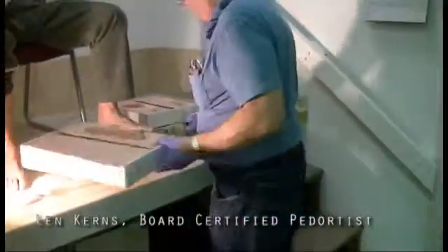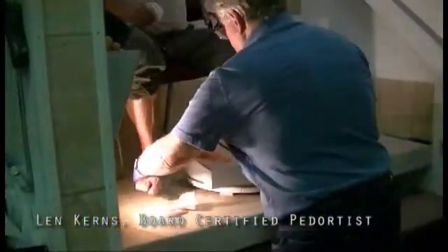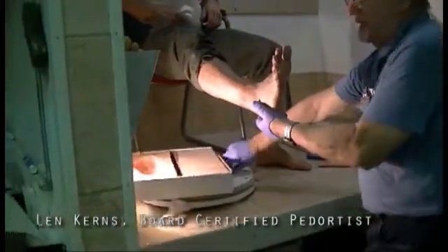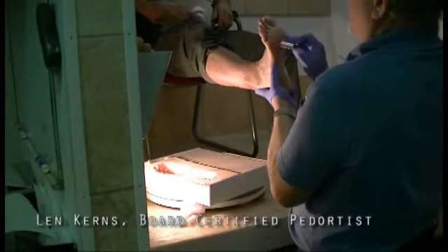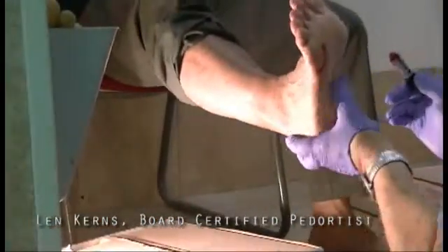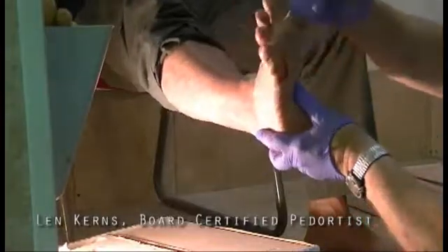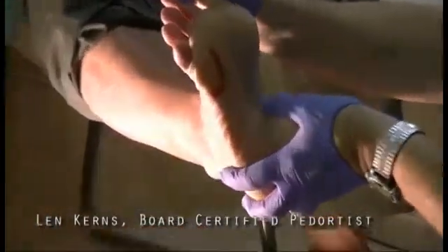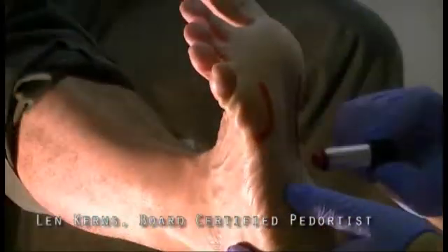Now, with the rotator, we're going to turn the box around, unrelease the brake, and you slide it way over here. And now we'll put lipstick over here, in case there was a wart, bony problem sticking out. Also, the tendon, it's running across from the sesamoid bone back to the heel. As I dorsiflex this big toe, you see the tendon right here. And I'm marking that.